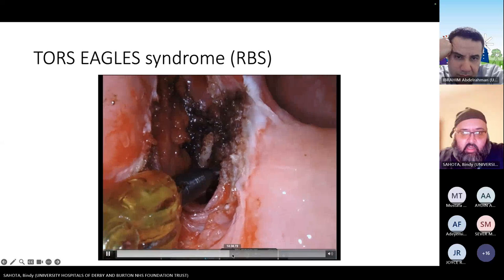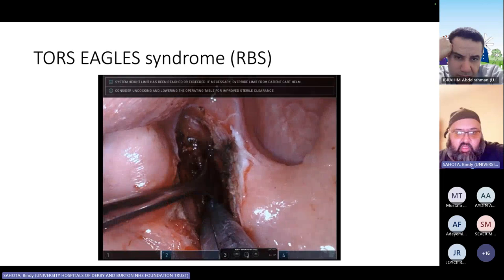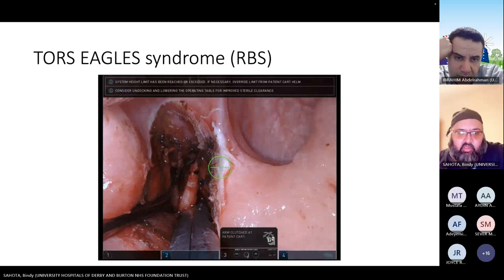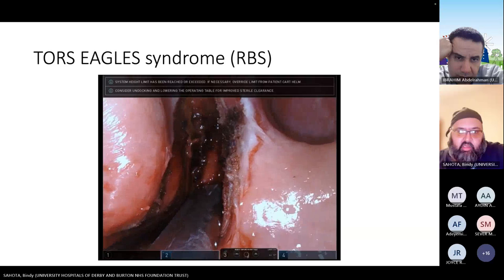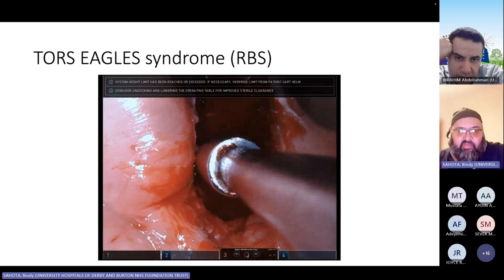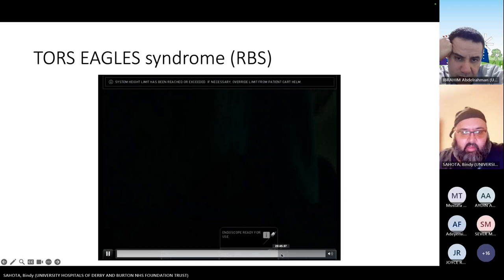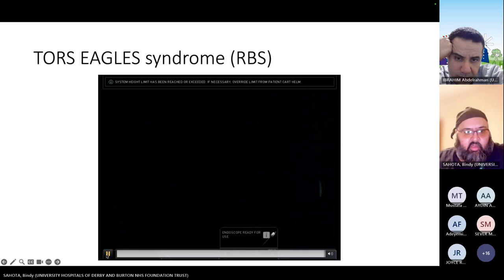Unfortunately, that's it being mobilized there. And you can see it there with the rongeurs being cracked, basically. So that's going to bite through. And there's the first crunch to mobilize it. And there's always blood, because there's loads of blood vessels here. So you just got to be really, really careful with it. So we're going to whip that out. I'm not sure if I actually pop it back in till the end. Apologies. But you come across that with the rongeurs, you clip that at that point in time.